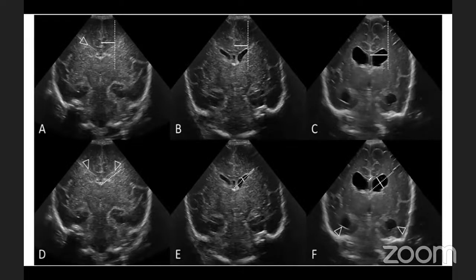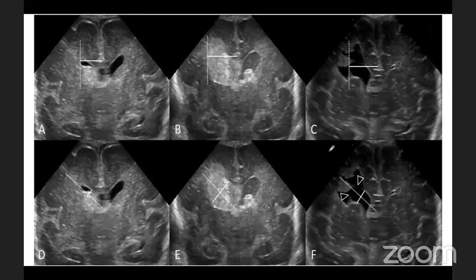In the image below, if the ventricles are dilated, you can appreciate it here. Draw the imaginary line through this, and then measure the anterior horn width in this plane. This was to show you further how difficult it sometimes is when there is a huge hemorrhage, because you cannot appreciate the lateral boundary as well when measuring the ventricular index.